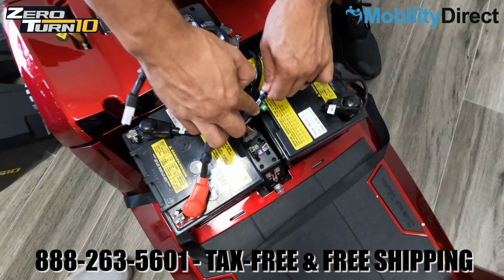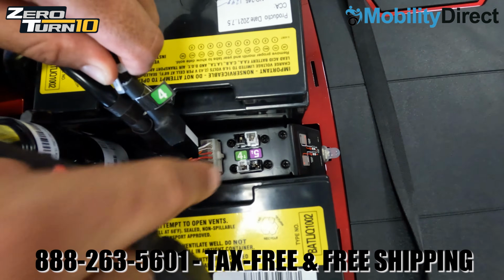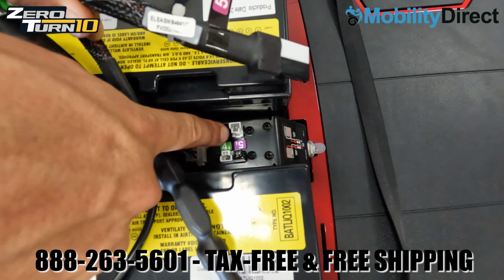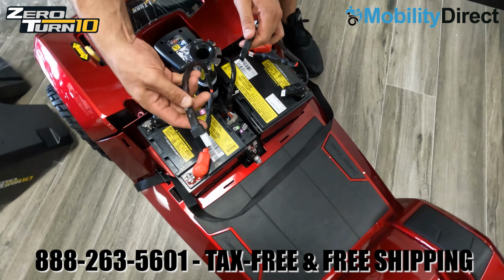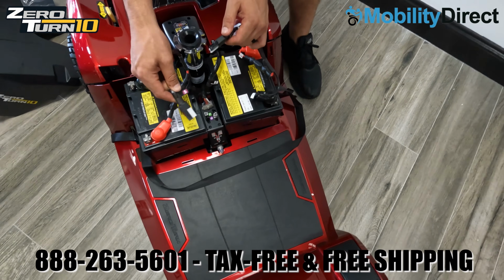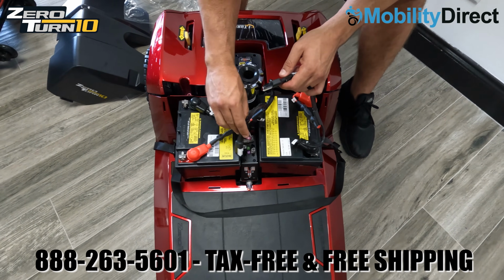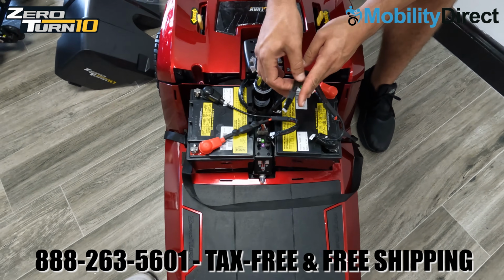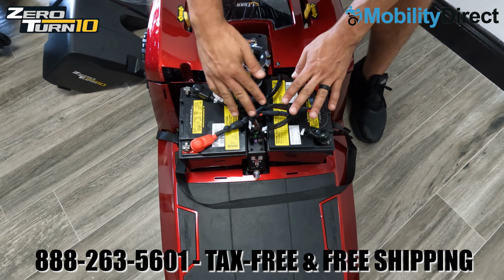So go ahead and locate the sticker. We're holding number 4 here, and there's a green plug that says number 4, as well as the other white and black cable that says number 5. We're going to match it up with the number 5 label to plug it into those 2 ports. So make sure you connect them the right way, as we're showing you here. Just plug them in. Make sure that the white side's on the white side, the black side's on the black side, and that the numbers match up with the stickers.